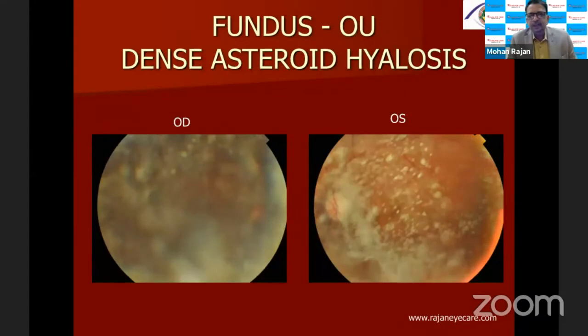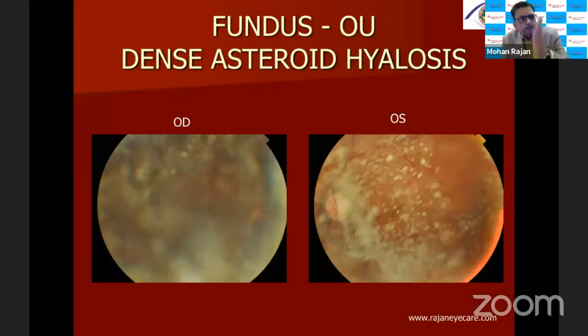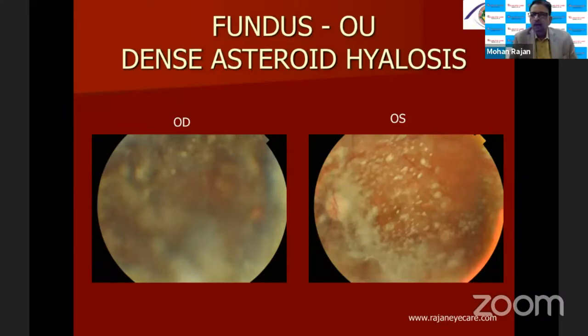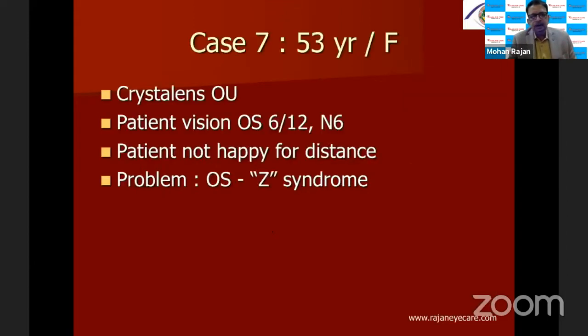What is the reason for this patient? This patient had asteroid hyalosis in both eyes, okay? I discussed this with Samuel Masket and Warren Hill as well. Probably a contraindication for a multifocal lens, dense asteroid hyalosis, though the macula was normal preoperatively. But the problem is that asteroid hyalosis alters the refractive index, and probably you're not able to get the power of the lens properly. I did an IOL Master, Lenstar, immersion A-scan, all of them showed preoperatively and postoperatively the same power, but still I had to explant the lens.